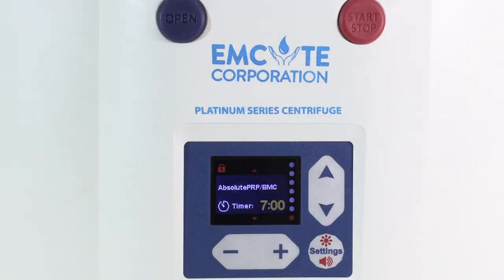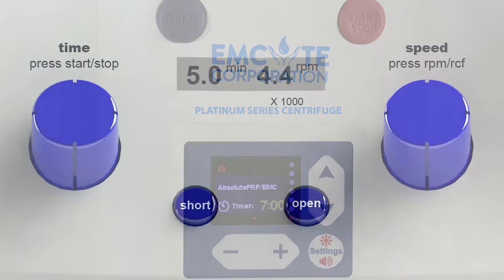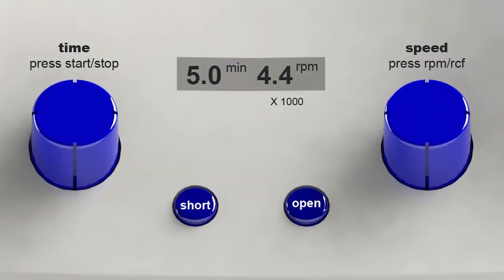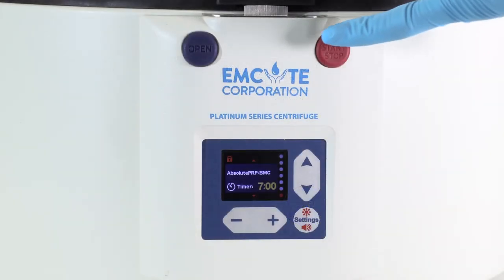Set the Platinum Series centrifuge at absolute PRP. Set the Executive Series centrifuge at 5 minutes and 4,400 RPMs. Close the centrifuge lid and press start.